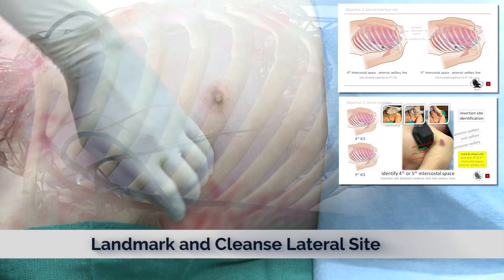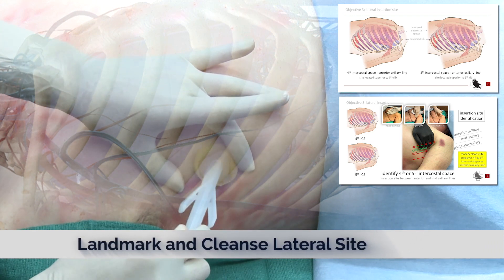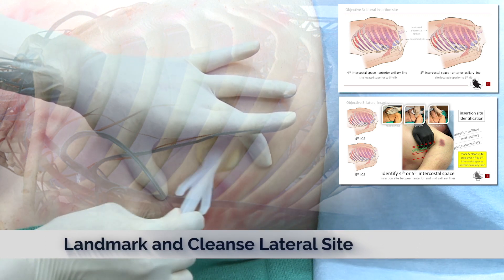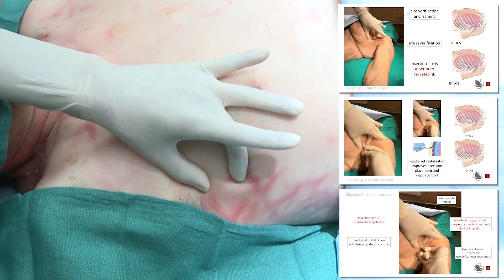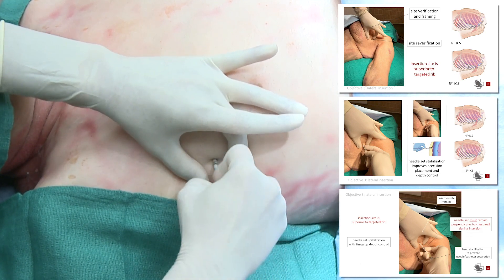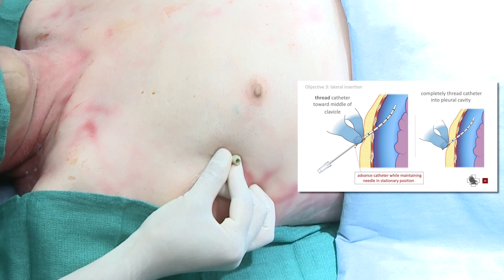Landmark and cleanse the lateral site. Frame the insertion site, nick the skin, and identify the target rib with the needle tip. Insert the catheter with control. Thread the catheter toward the clavicle, keeping the needle stationary.